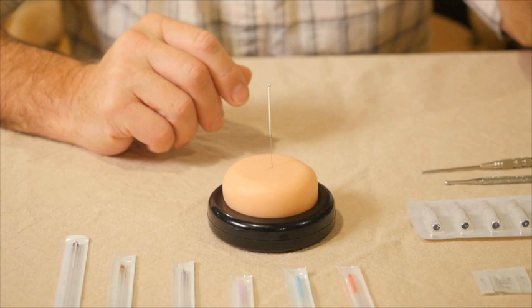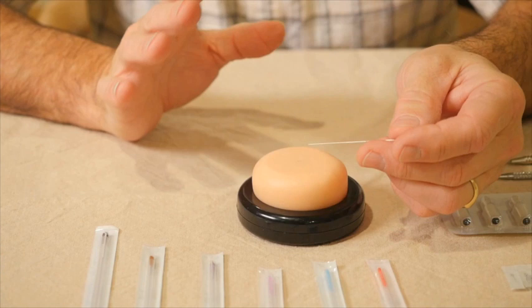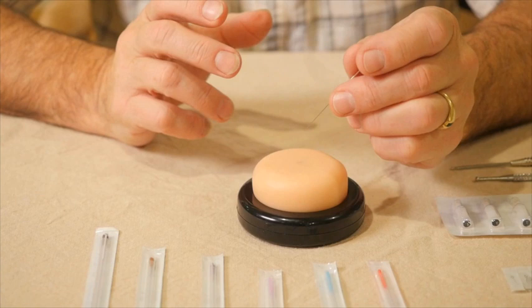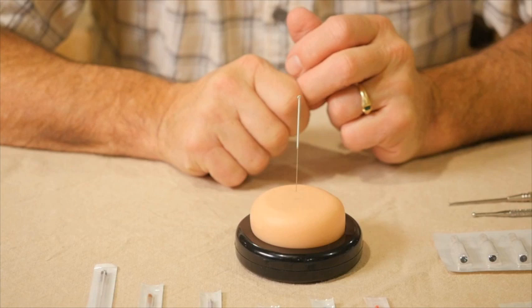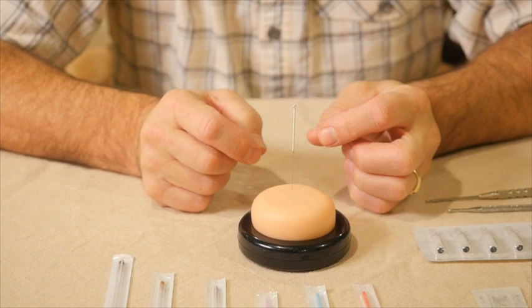We want to choose our acupuncture needles based on their length and also their thickness. The thickness is oftentimes simply based on a practitioner's preference — some practitioners like a heavier needle, some like a thinner needle. There is certainly a degree of comfort for the patient associated with needle thickness, and a very thick needle will be a little more painful to insert than a very thin needle.